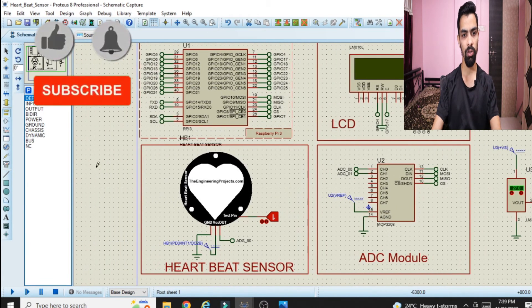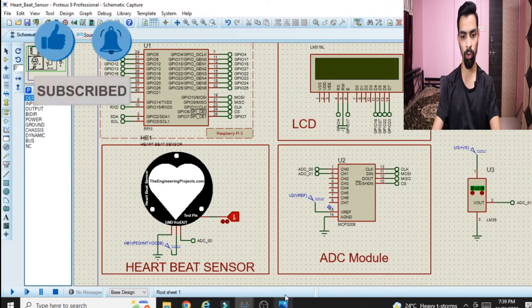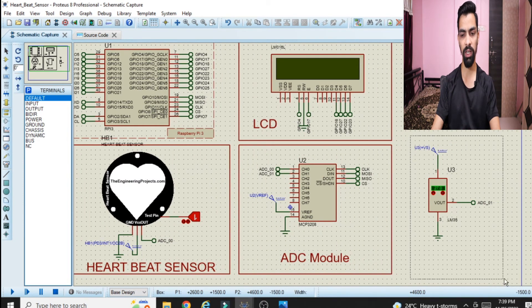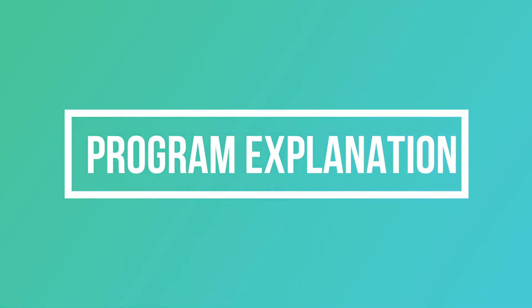In this way we have completed the LM35 to Raspberry Pi connection. This is the complete circuit diagram. To build the full circuit you must watch the first part of this project — from that video you can implement Raspberry Pi with LCD, heartbeat sensor, and ADC, and from this video you add the LM35 temperature sensor. Now we will see the programming part.